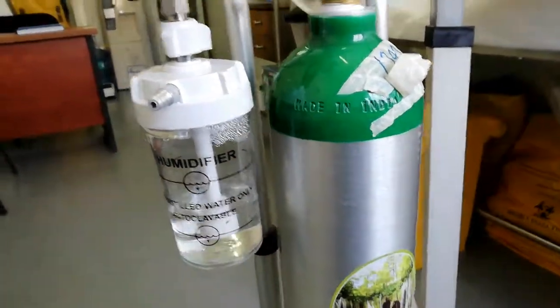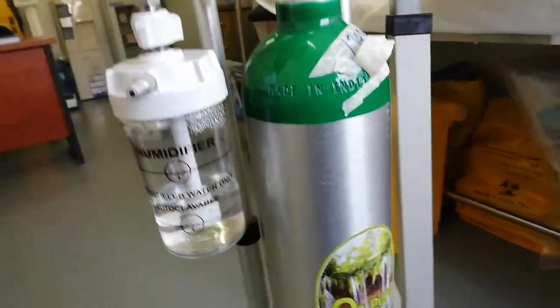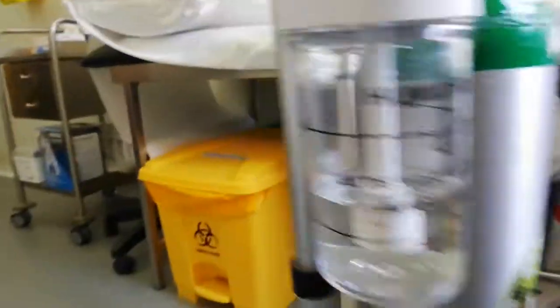This is made in India. This is something we are looking at with the oxygen cylinder. This is the first time we have done this in Mumbai.